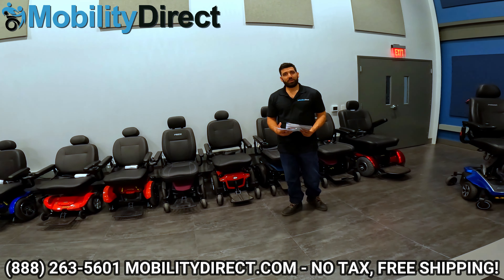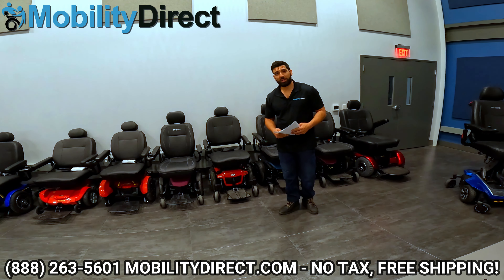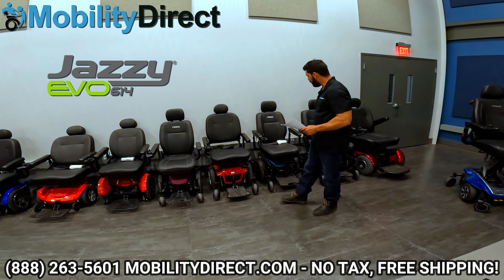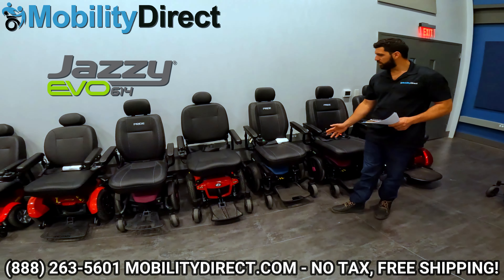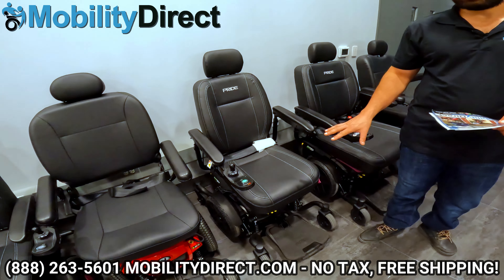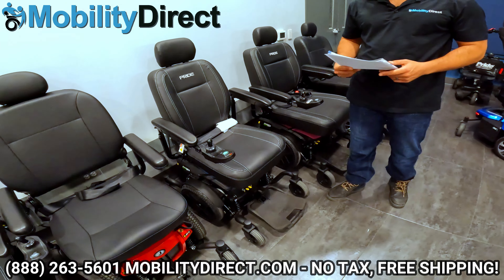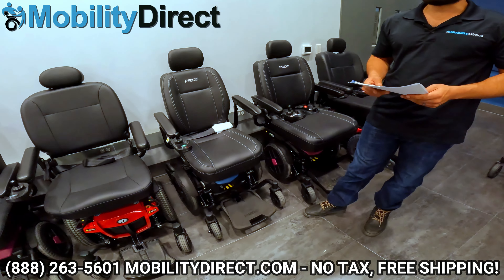Hi everybody, I'm Sergio with Mobility Direct and welcome to our YouTube channel. Thanks for stopping by. In today's video we're going to give you an in-depth review of the Jazzy Evo 614 Power Wheelchair by Pride Mobility. This is a brand new power wheelchair that was just released and we wanted to give you the rundown on it so that you can know what to expect if you decide to come into one of our stores or order it online.